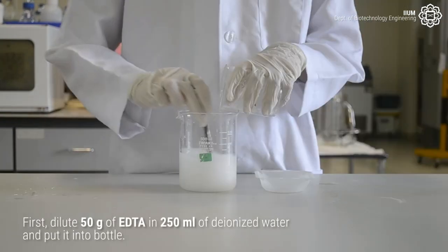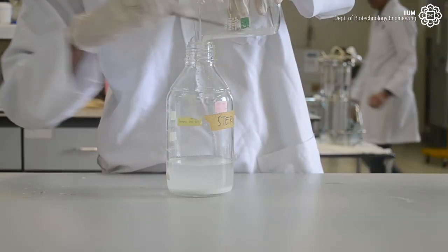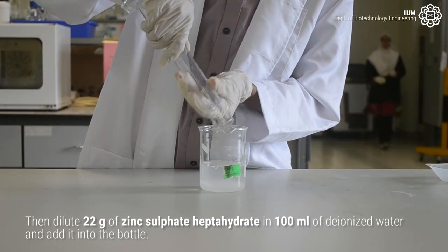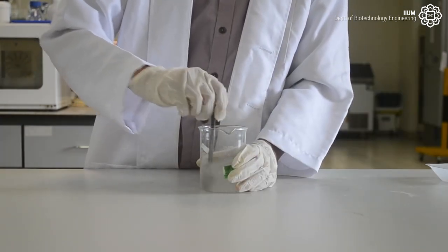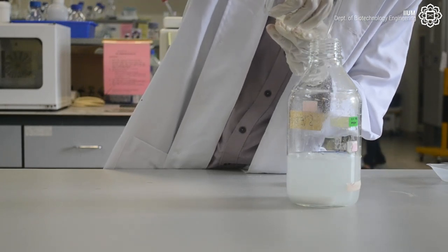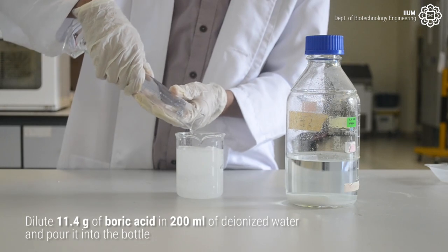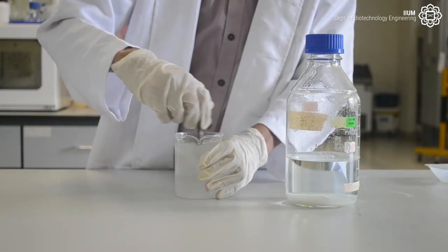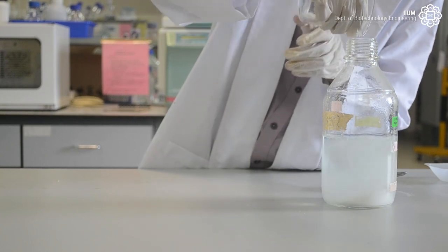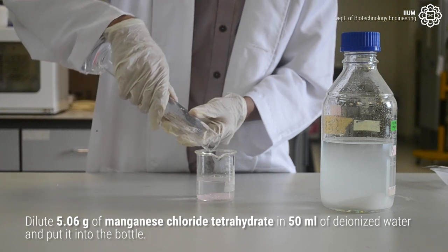Dissolve 50 grams of EDTA in 250 milliliters of deionized water and put it into the bottle. Then dilute 22 grams of zinc sulfate heptahydrate in 100 milliliters of deionized water and add it into the bottle. Dilute 11.4 grams of boric acid in 200 milliliters of deionized water and pour it into the bottle. Dilute 5.06 grams of manganese chloride tetrahydrate in 50 milliliters of deionized water and put it into the bottle.